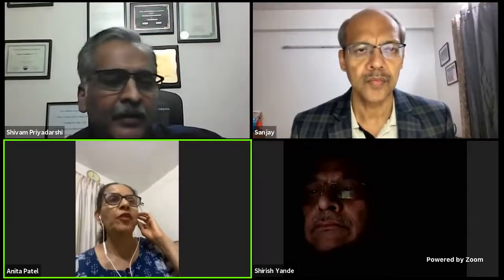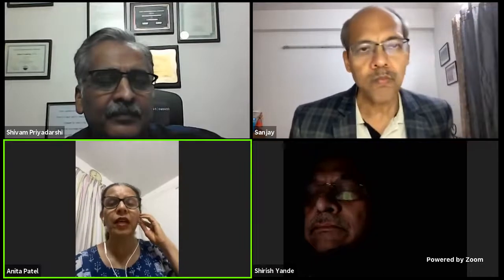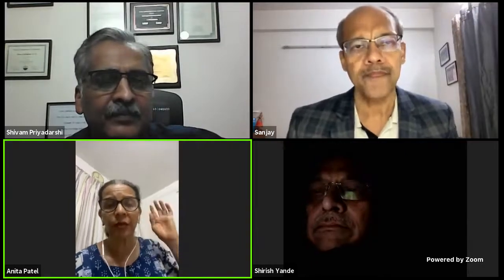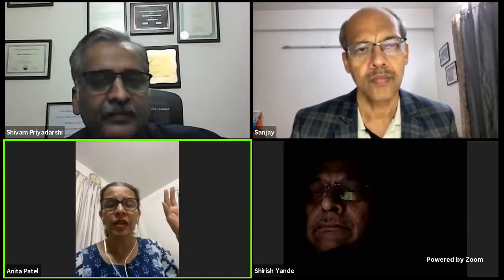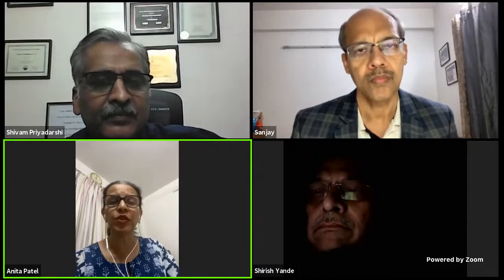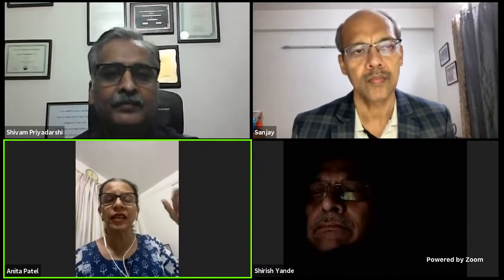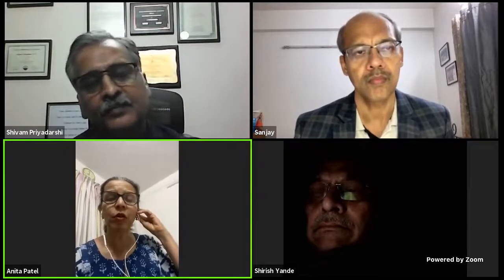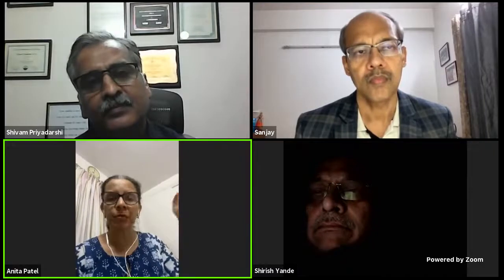Okay, so first of all, it would be ideal if anybody with interest in urodynamics has access to video urodynamics. So that is the best option. If you do not have it, make sure you have adequate pre-urodynamic imaging available so that at least you filter out those who may need either a simultaneous imaging or who at least need a separate pre-procedure MCU.